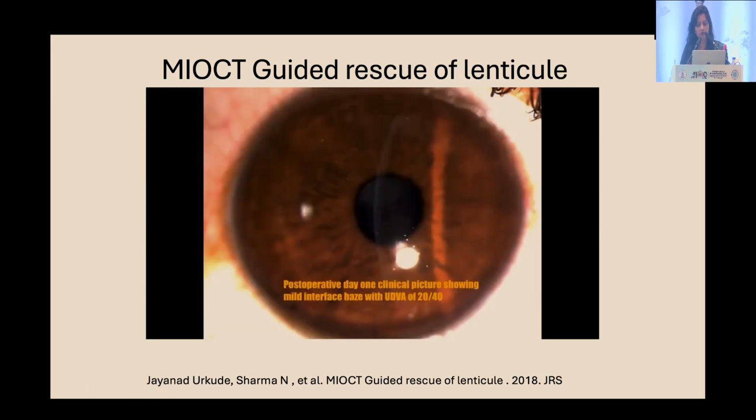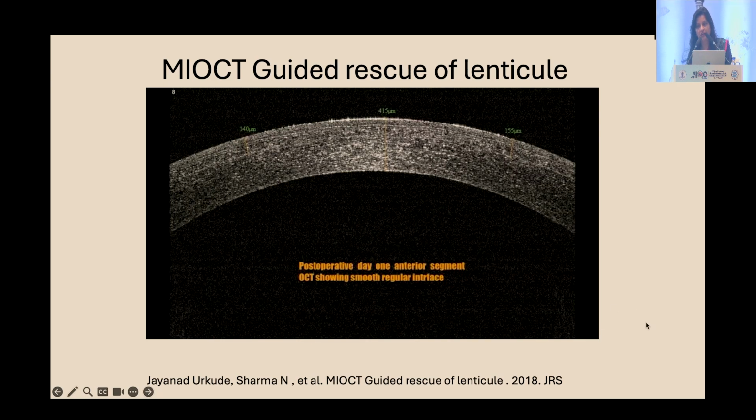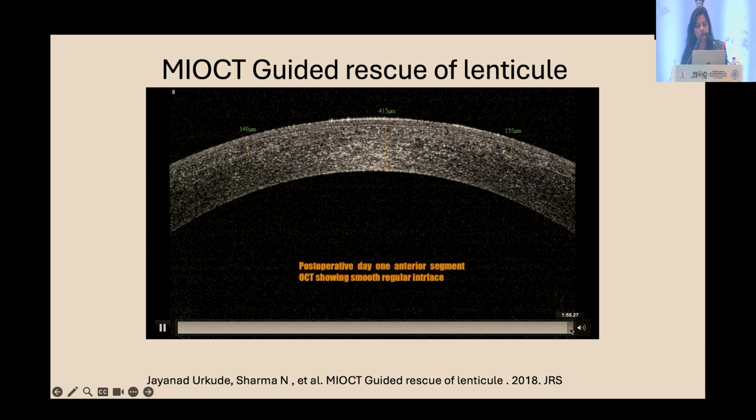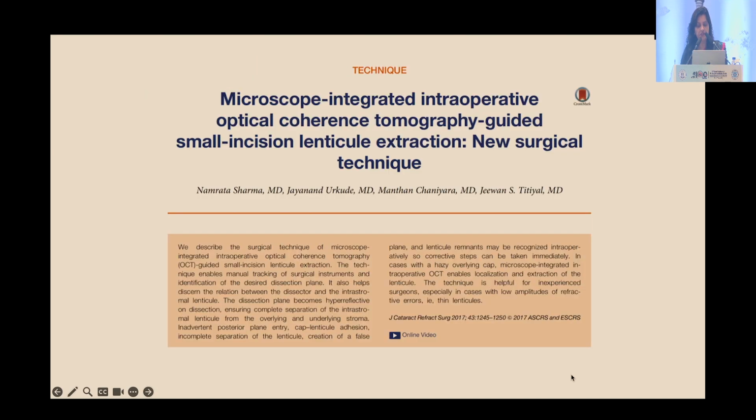The only problem is that both our machines are on different floors, so we have to shift the patient from one floor to the other because the intraop OCT microscope is not placed on the same floor. But the current machines have the intraop OCT microscope integrated into the lenticular platforms, and I think that is the way to go, especially when we have all shifted almost to lenticular surgeries.